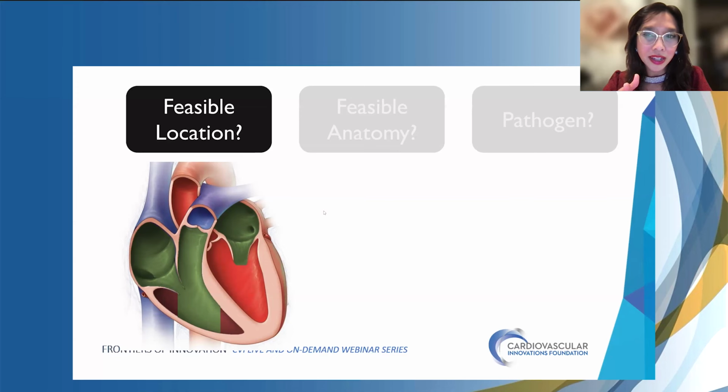And I think we had a case, Sanjam, back in Colombia, where we really went to the transgastric. And I remember it was stuck on the cords and you were trying so hard, that small vegetation. And in the end, we gave up. I remember that case very well because it was really stuck on the cords. And so really, I think we went IJ as well for that case.